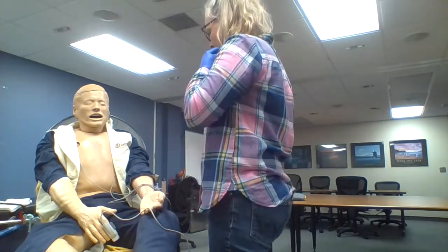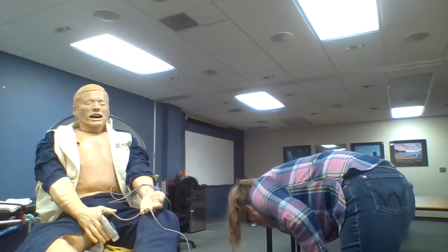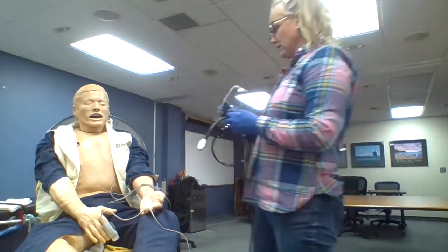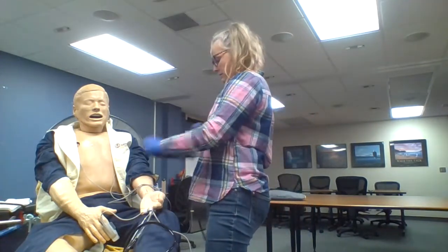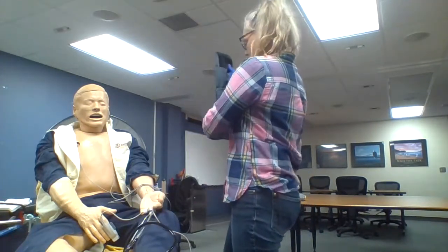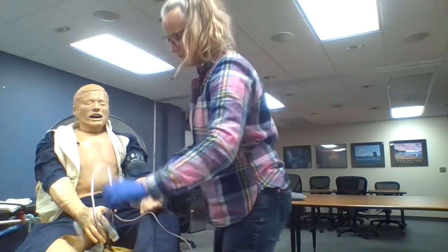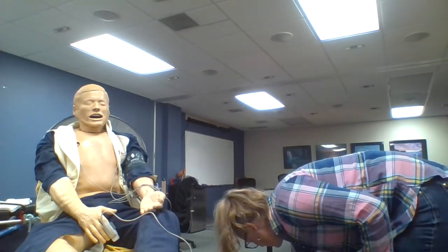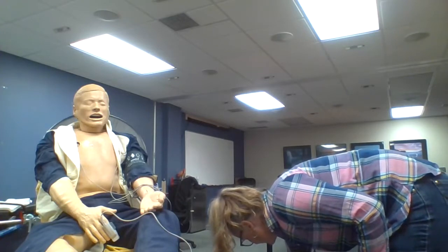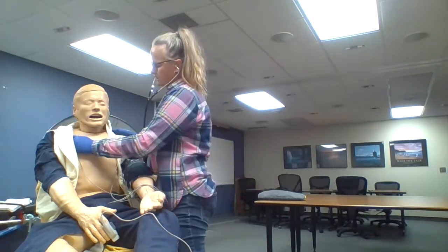Not normally. No, okay. So if I put on my monitor here, I've got oxygen saturation. I've got an ECG for lead 2 on. I'm going to put on a quick blood pressure cuff here as well to do your vital signs. Have you had a fever at all, Pat? Yeah, I have, but not now that I'm aware of. Okay. So we're just going to send this. You're going to feel a bit of a squeeze on your arm. I'm going to listen to your chest here, okay? Can you try to take some nice breaths for me?